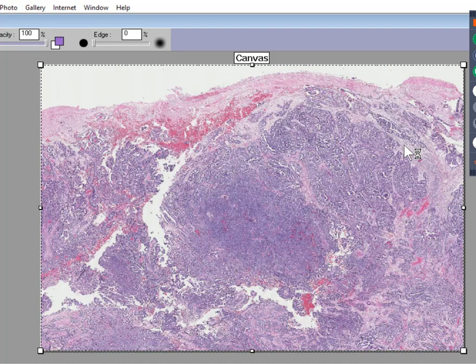And you're going to have to believe this is an ovary, because it is an ovary, but it's filled with these clusters of cells. You don't see normal follicles, you don't see normal stroma, you don't see corpus luteum, you don't see corpus albicans. Instead, you see these dark clusters of cells replacing and invading the substance of the ovary. So even before we look at the cells to determine what they look like, or if they're epithelial or non-epithelial, we will tell you this already looks like an ovarian cancer.